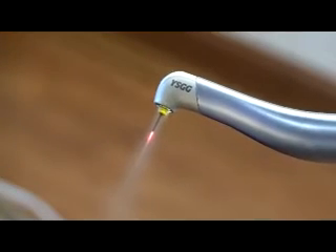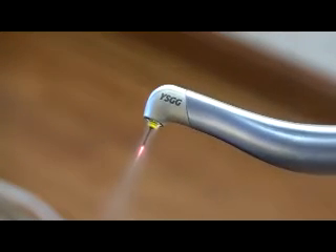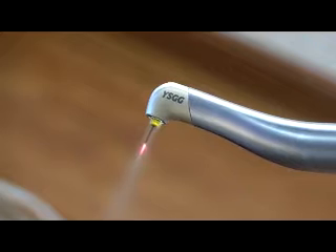The addition of the WaterLaze Dental Laser to our practice has changed the way we perform many traditional dental procedures. Fillings and other dental treatments can be performed often with little to no anesthetic required at all. Our WaterLaze Laser uses light energy and a gentle spray of water to perform a wide range of dentistry without the heat, vibration, and pressure associated with the traditional dental drill.